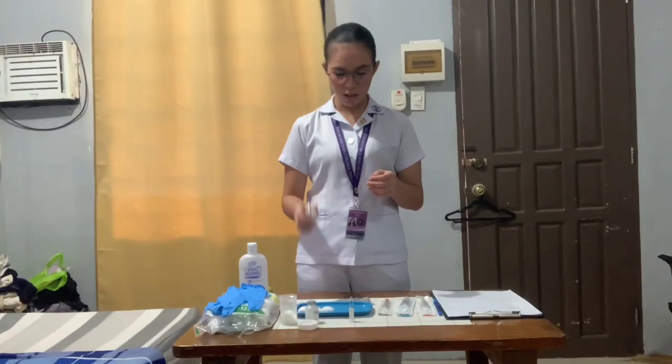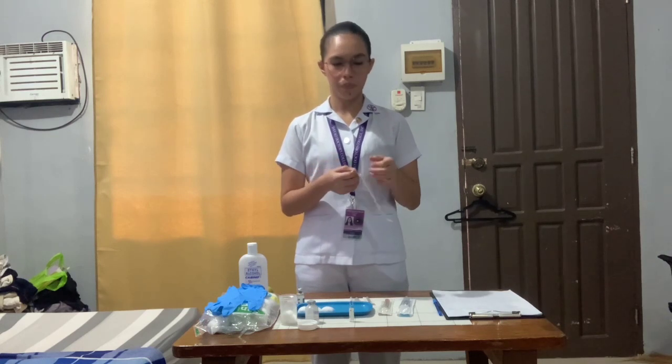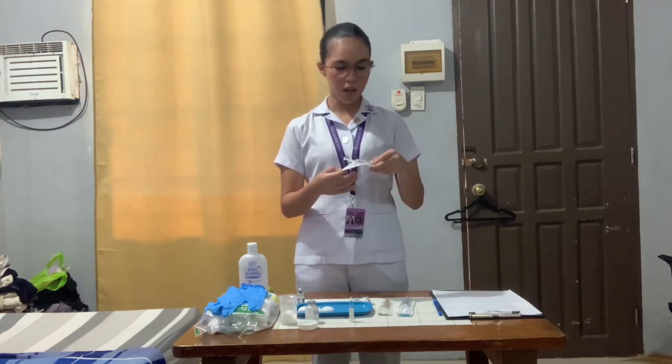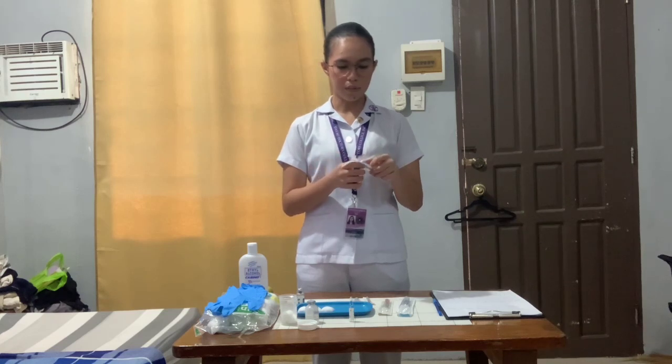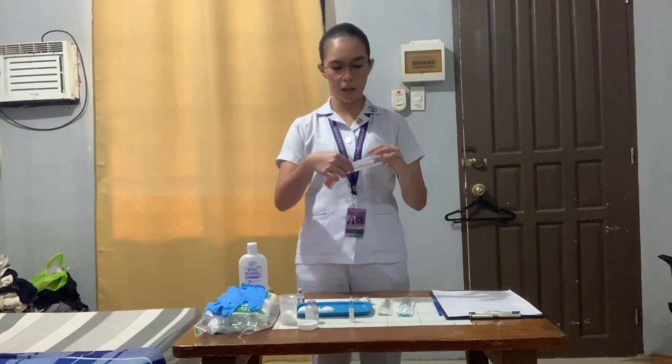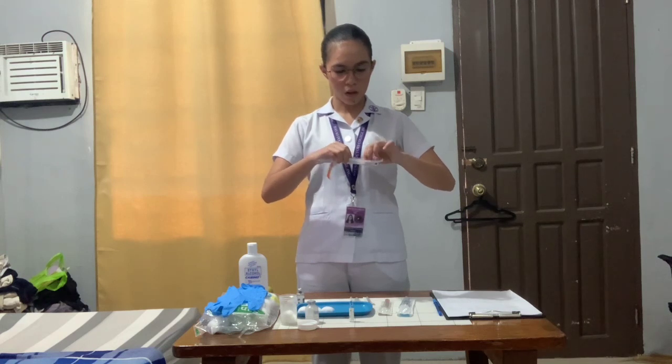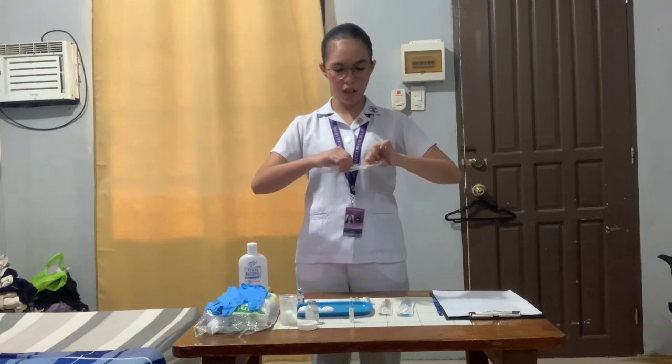So now that it is clean, we are just going to prepare our needles. In preparing the needle, we are just going to open this halfway, making sure that we are just opening the barrel of the plunger and the barrel of the syringe, and then we are going to loosen up the needle of this syringe.